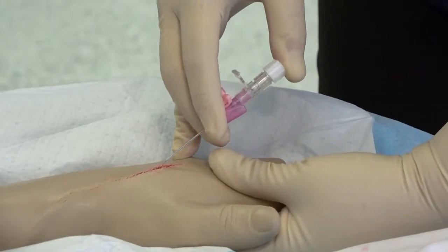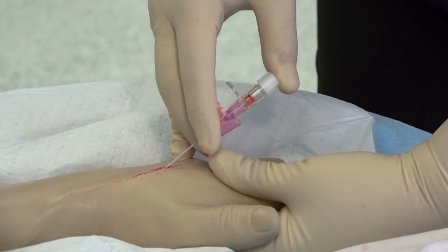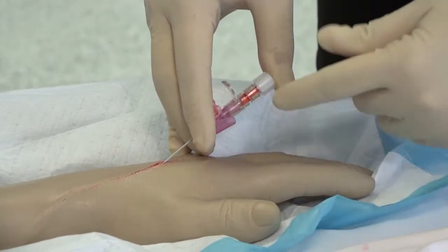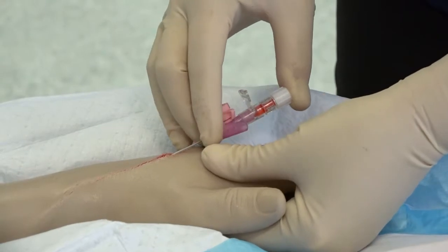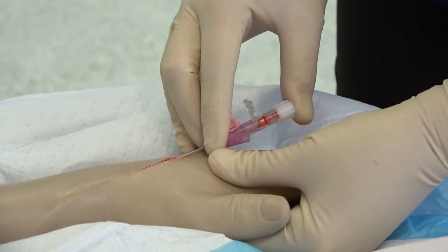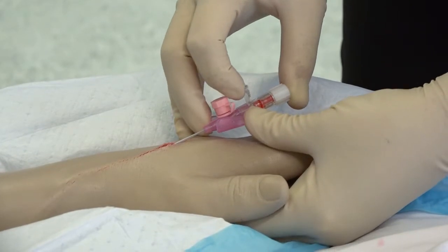Insert the needle at an angle of 15 to 20 degrees depending on your assessment of vein location. Continue to insert the cannula at a downward angle until you feel a loss of resistance and a flashback is seen. Reduce the angle of the cannula to the horizontal and advance the cannula a few millimetres forward to ensure it is in the middle of the vein.